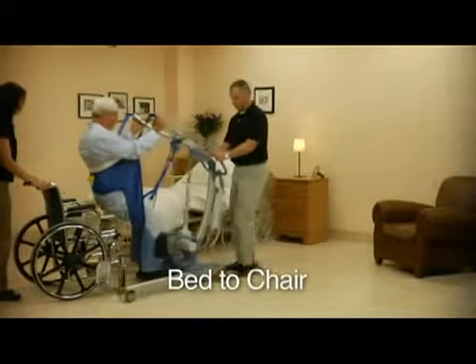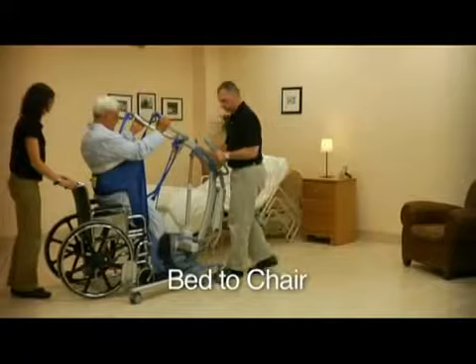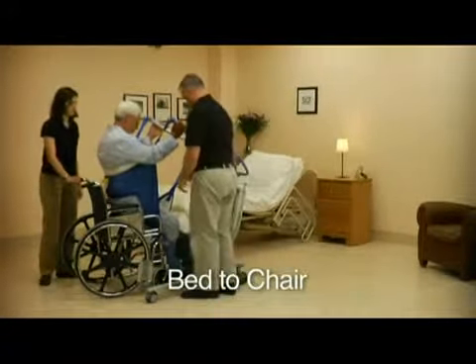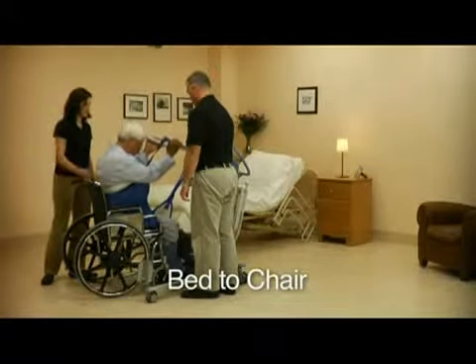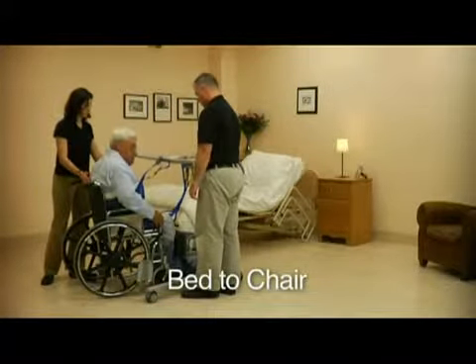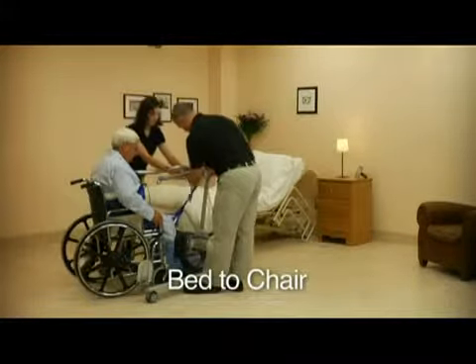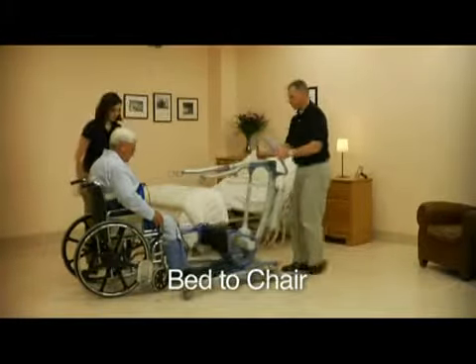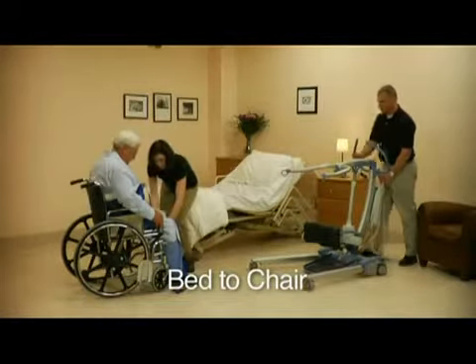Use the hand control to spread the S440's leg base, allowing you to position the client in the most convenient manner possible, such as directly above a chair. Remember, if lowering the client into a wheelchair, the chair must be immobile with its wheels locked. The S440 is easily maneuvered without strain, and when the client is safe and comfortably sitting, slide the sling out from under them.